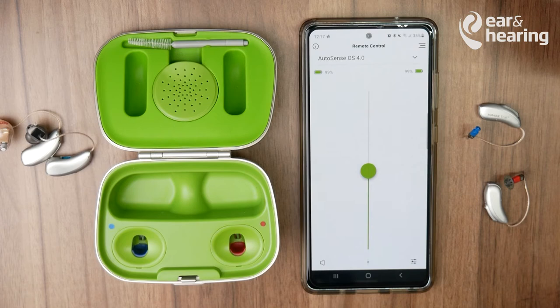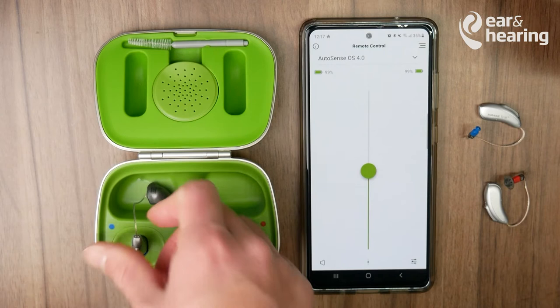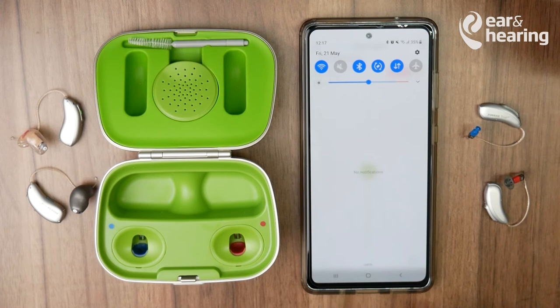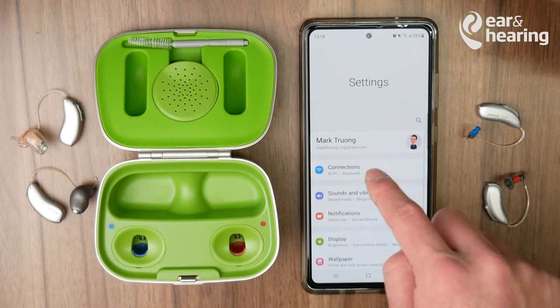If your hearing aids aren't pairing properly, go through that process once more — place them inside the charger or turn them on and off, then pull them back out of the charger. Then go into the Bluetooth menu by swiping down and hitting the settings cog.